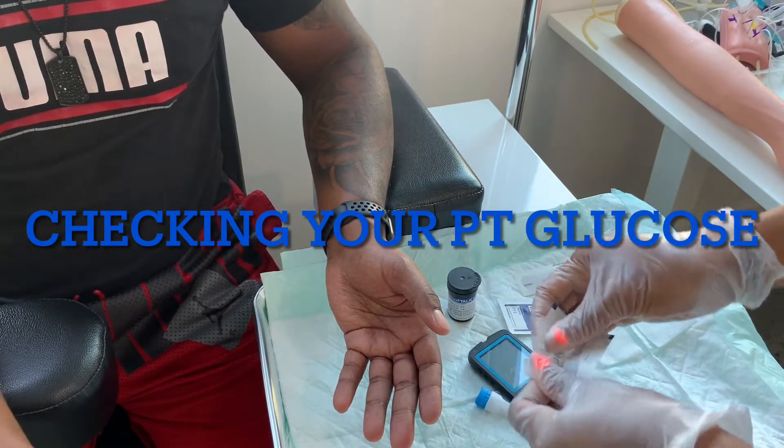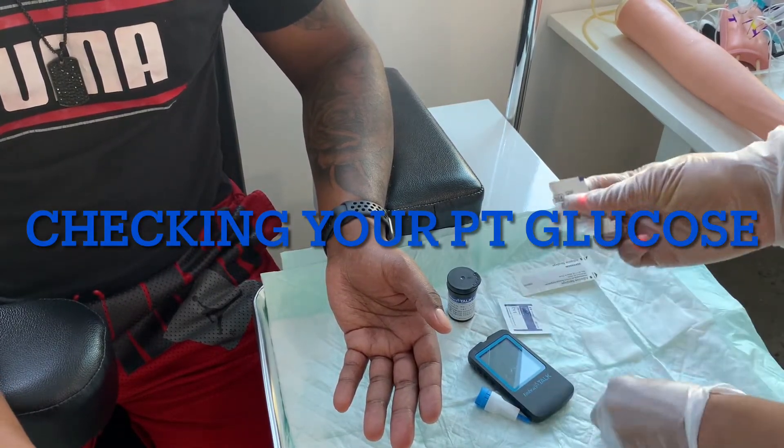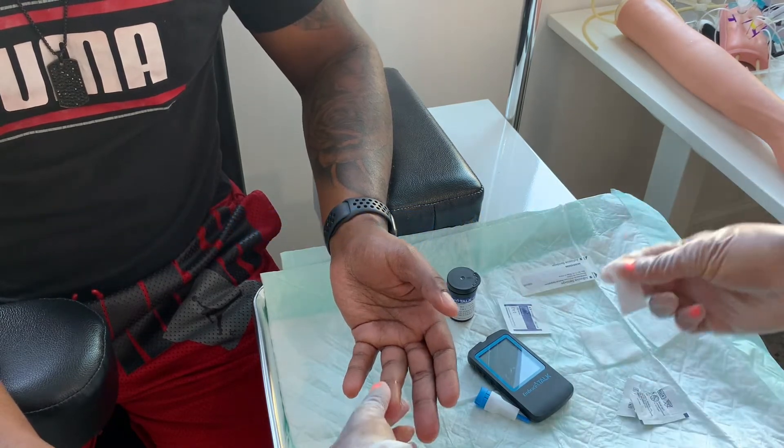Today I'm going to show you how to perform a glucose test. So you're checking for glucose, which stands for sugar.